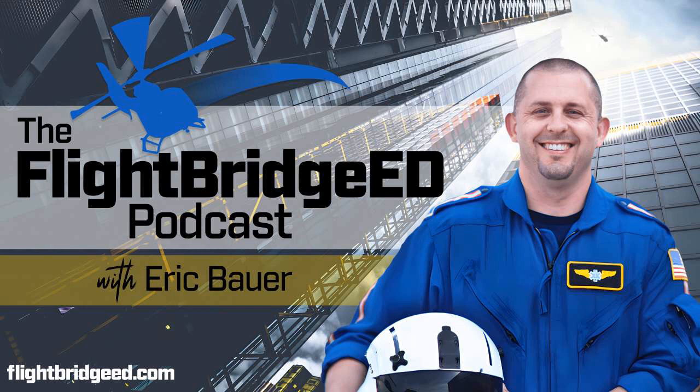Remember, qualitative is a good backup. It's not utilized much anymore. It does have its benefits as far as it's very quick. You can put it on, but remember there's problems with it. Understand the correlation between end-tidal CO2 and arterial PaCO2, and that your PaCO2 is never going to be lower than your end-tidal CO2. Your end-tidal CO2 is going to be a good gauge of where your arterial CO2 is, and you can titrate that.